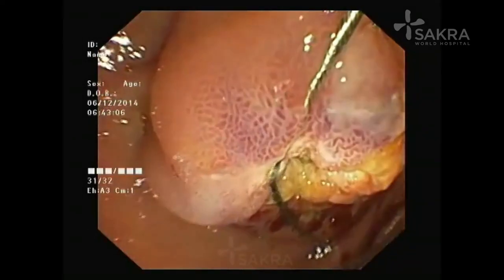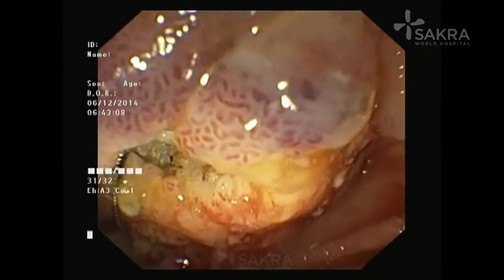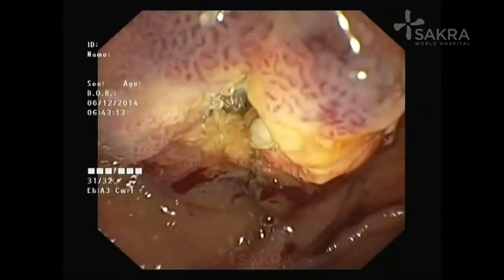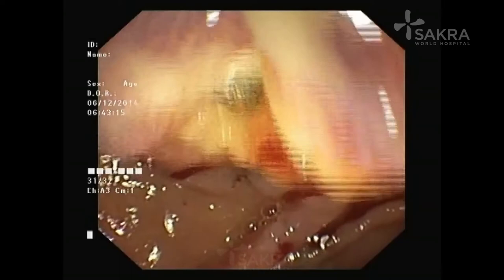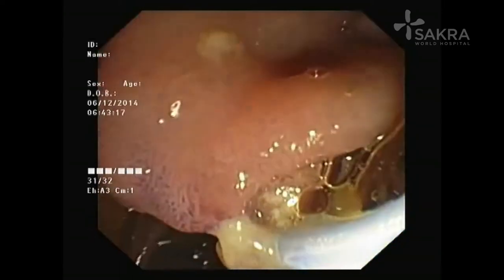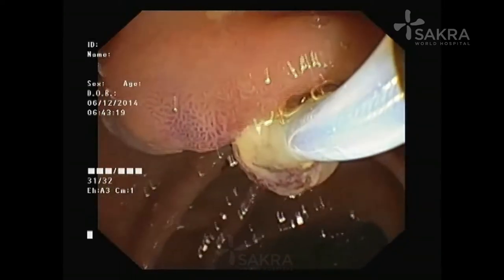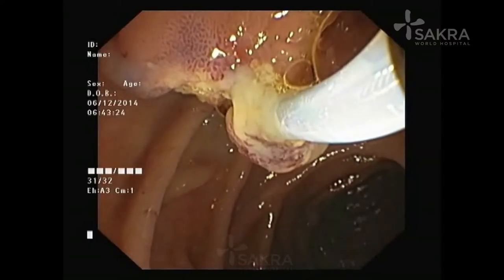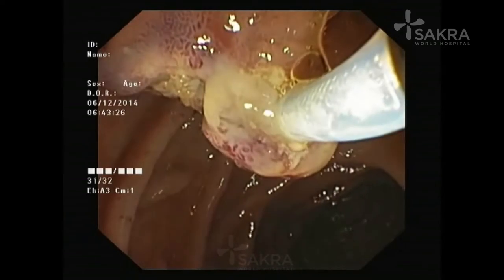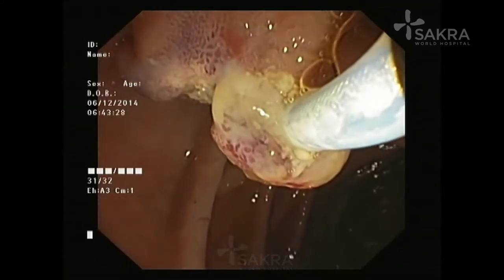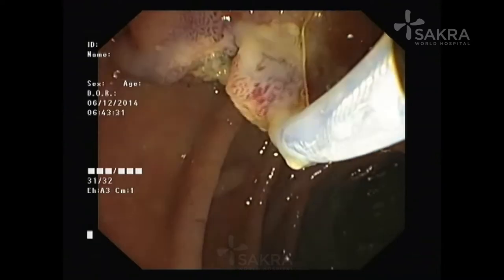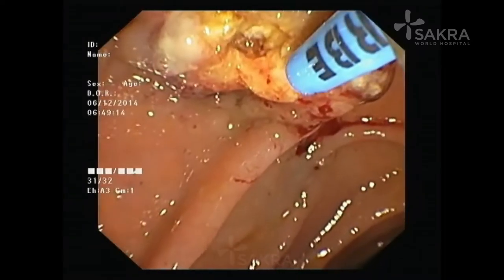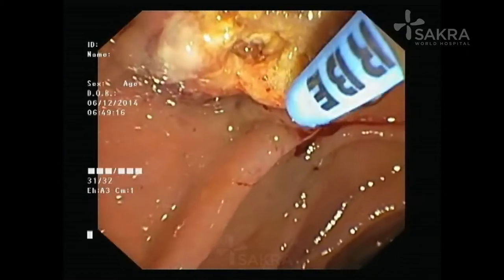For a large ampullary adenoma, piecemeal resection may be necessary. In this case, we felt there was a small amount of tissue remaining, so we are using the snare again to remove the residual tumor tissue. This piecemeal removal technique ensures complete clearance of the adenoma.